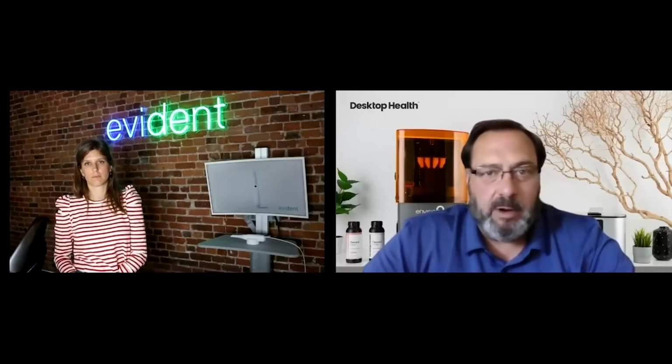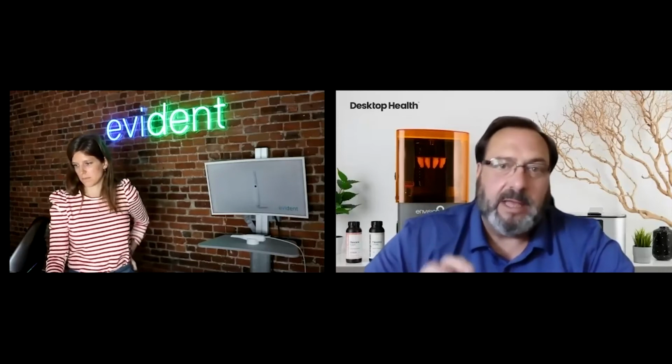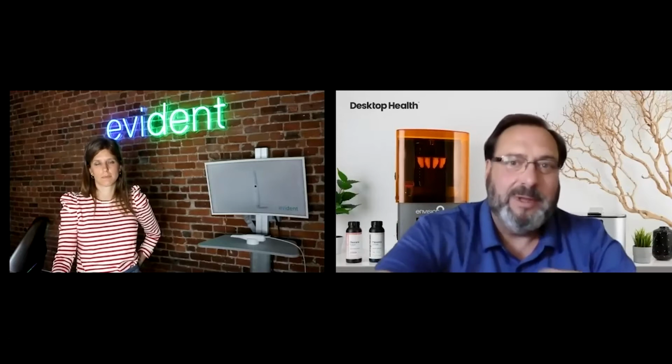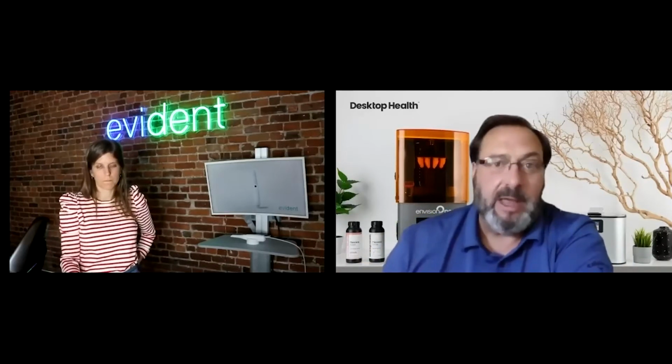You can scan them in, or you can take a traditional impression and scan the model in, mark where your landmarks are, your retromolar pad, your incisive papilla, your central relation record, all of that stuff gets put into the software, or in your case, sent to you. And then that is designed to the specifications of the patient, what the patient wants. It gets sent back to the doctor, and then the doctor can print it in their practice and provide it to the patient in a very short period of time. It's just mind blowing when you really think about it.